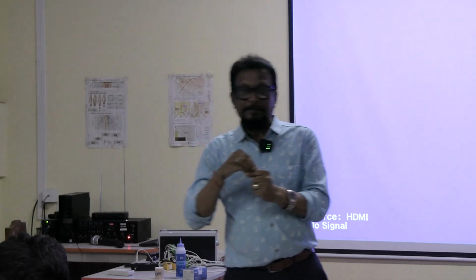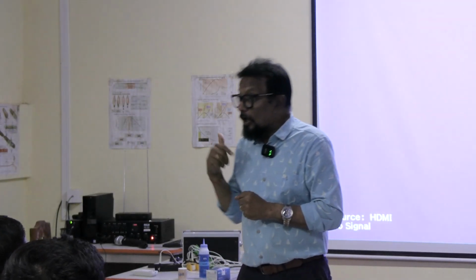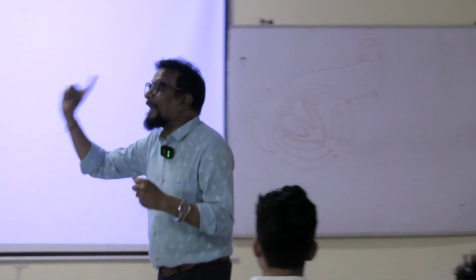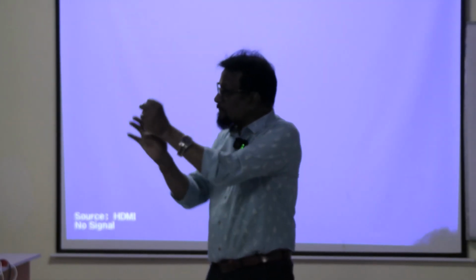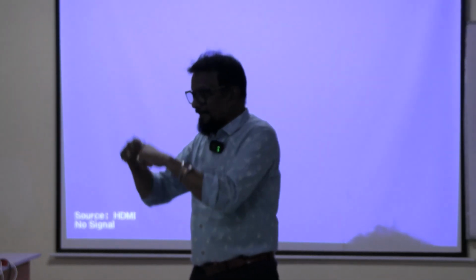These positive electrodes are called active electrodes or exploring electrodes. Now I can place this active electrode on my left palm. The other three negative electrodes are joined together, and the result is 0. This is Einthoven's law.